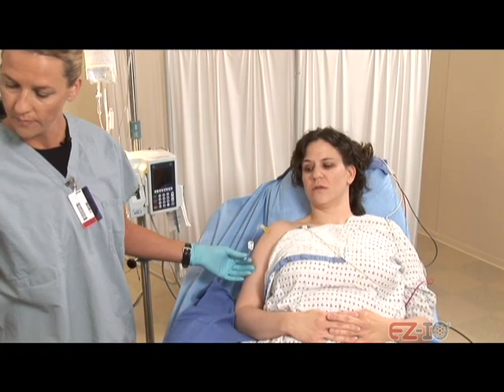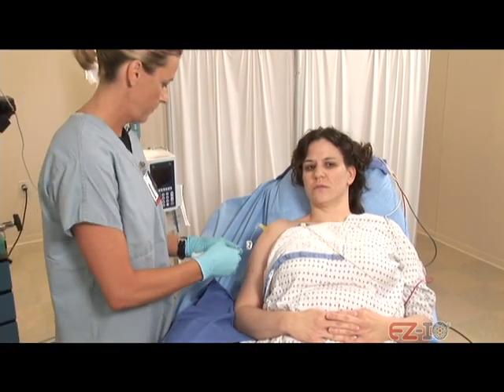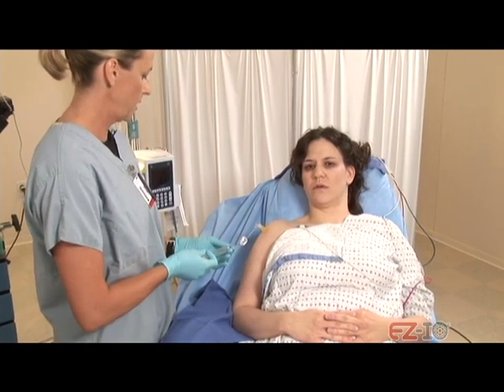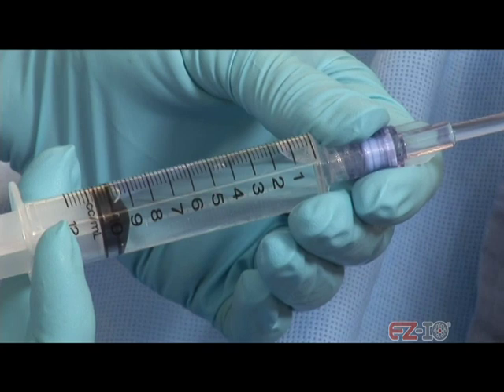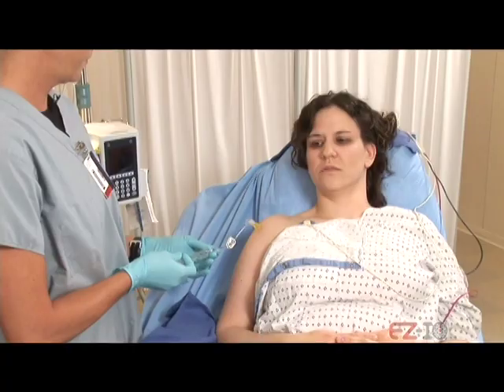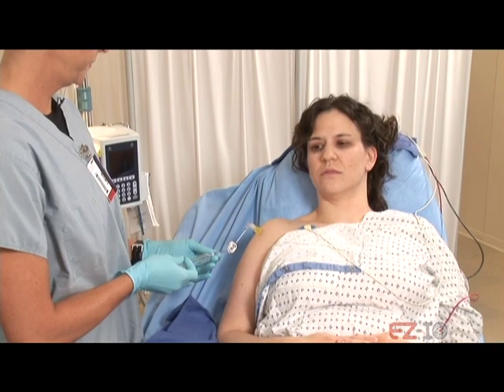Medications intended to remain in the medullary space, such as a local anesthetic, must be administered very slowly until the desired anesthetic effect is achieved. If the patient is alert or responsive to pain, prepare them for intense pressure associated with the bolus. So the rest of this, it's going to have to go in pretty quickly. So it's going to take me about 5 seconds to get that in, so I'm just going to count you through it, okay? Are you ready?